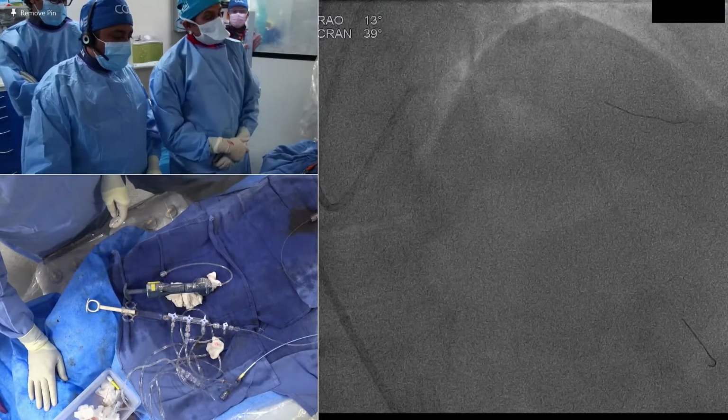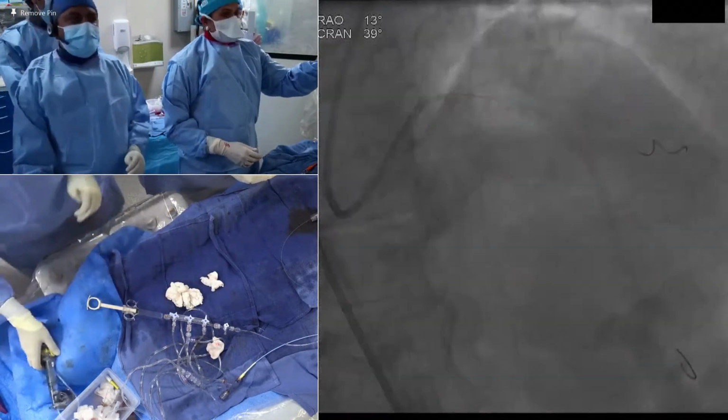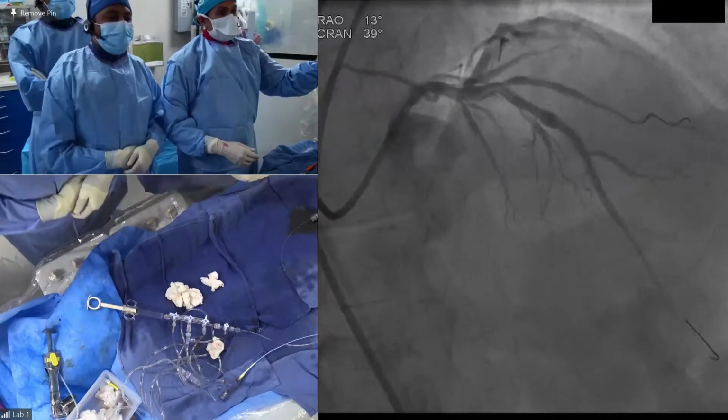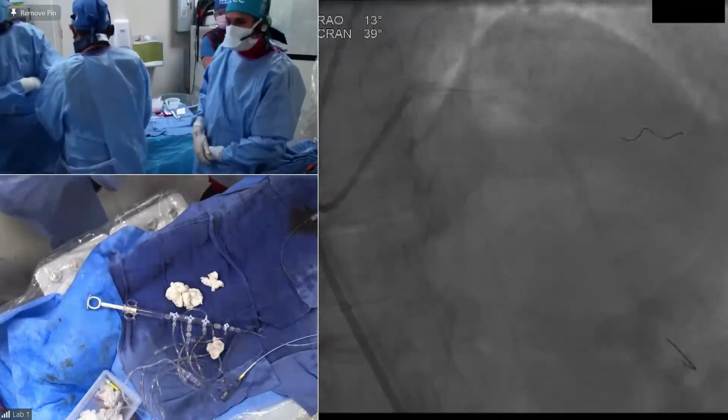All right, we'll try another off-label technique soon. Coming up. I warn you, don't try it at home. Okay, yeah. Don't try it at home and don't try it in New York and USA.